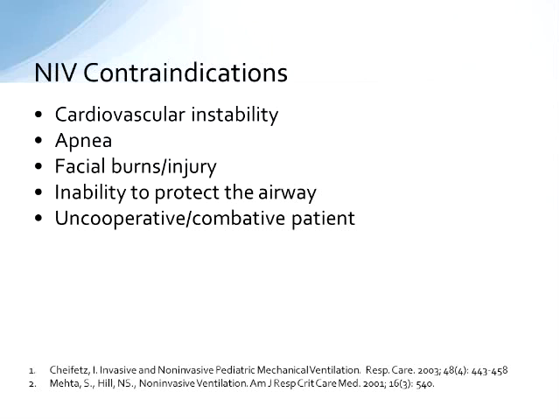The only way this works is if you have a patient that can be compliant with not just the machine but with the interface. So they have to be willing and able, if you will, and be cooperative with the device. So uncooperative patients don't work. I actually got a call last week asking me if it was okay to physically restrain a patient on non-invasive ventilation, and of course I said absolutely not. Patients have to be able to rip their own mask off in case they throw up so they don't aspirate. But again, that speaks to the fact that they have to be cooperative and non-combative to be a patient eligible for this modality.